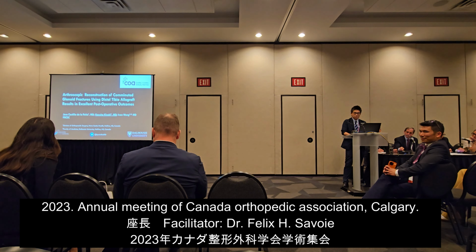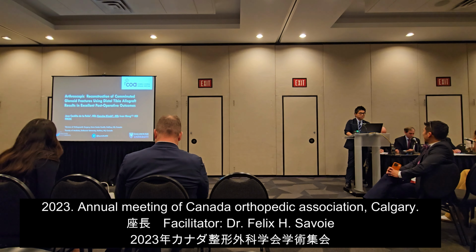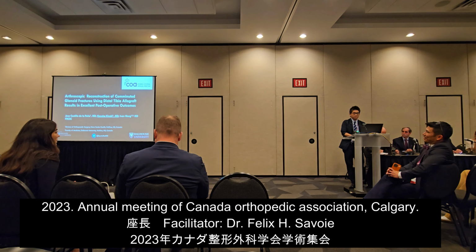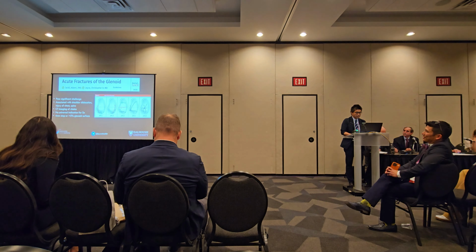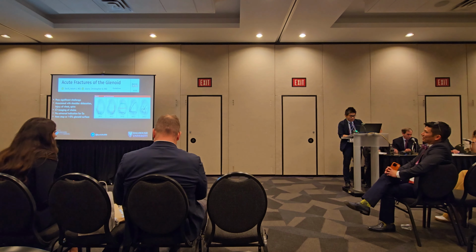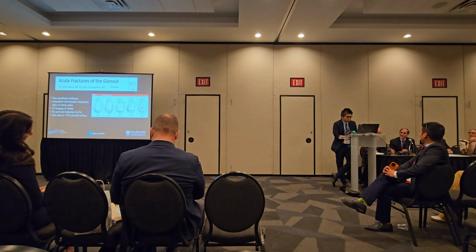Arthroscopic reconstruction of comminuted glenoid fracture using a distal tibial allograft results in excellent postoperative outcomes. These are our disclosures. Acute fractures of the glenoid are challenging to treat. Usually it is associated with a shoulder dislocation.